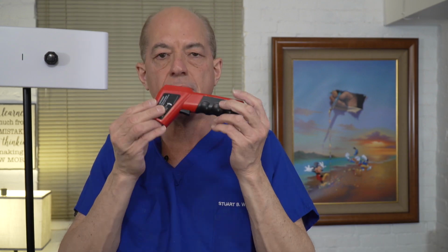This is only part of your plan, though, because the question is, what do you do if you get somebody that reads a high temperature? Well, these are only screening devices, both the active and the passive. You then need to actually take their temperature with a thermometer, which is the most accurate. And you also need to have a response capability. What do you do with a customer that comes in that has an elevated temperature? How do you handle them? What do you do with your venue? What do you do with the staff that took care of that person? So it's all part of a bigger plan.